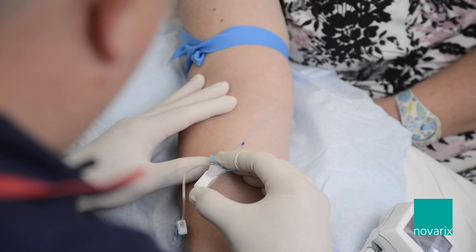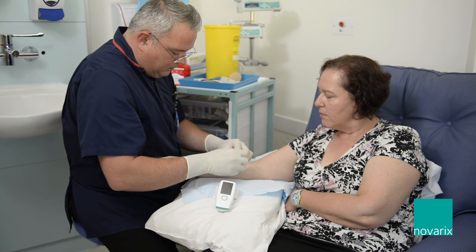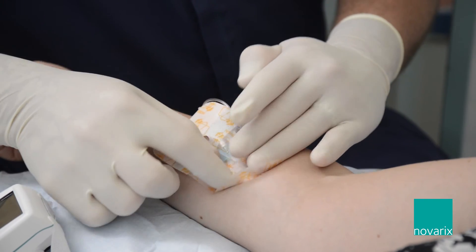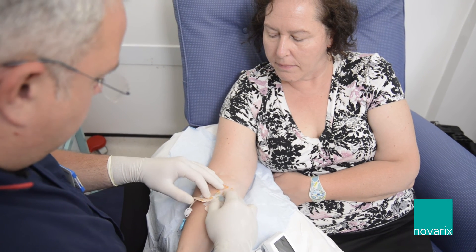The IVI can improve patient and clinical outcomes because it does exactly what it says on the box — it finds the vein quickly, and then you can easily insert the cannula or take a blood sample once you've located the vessel. It's a very good tool for vessel health assessment, and that can save time and money because you're not having to repeatedly cannulate the patient in a vein that isn't appropriate for cannulation.